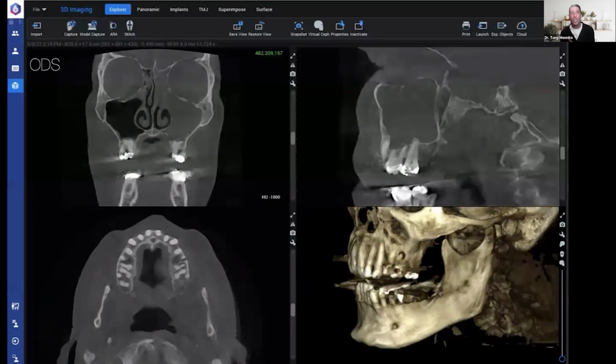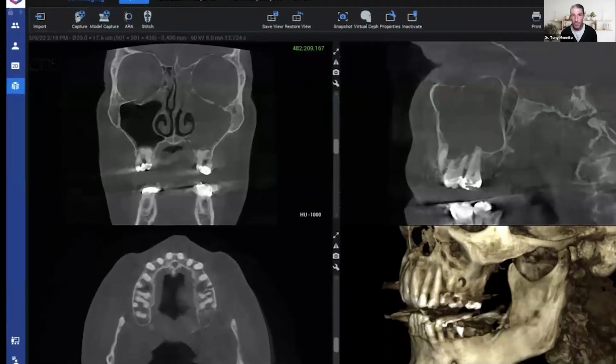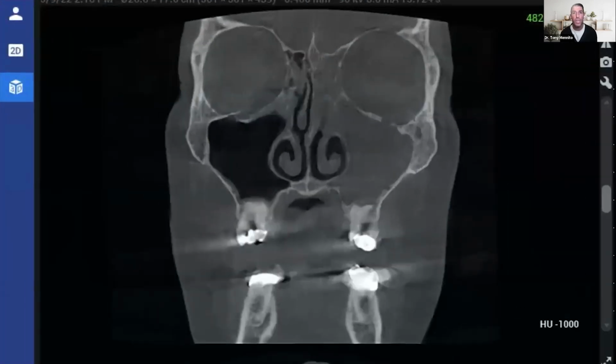And when we are able to diagnose better, we're able to treat better. So this was the patient who came in, and obviously we've got these 4 views that we can look at. But if we break it down for each view, when you're looking at it from this angle, we're essentially looking at the front of the patient's face, and we're always looking for symmetries when we're reading a CT like this.